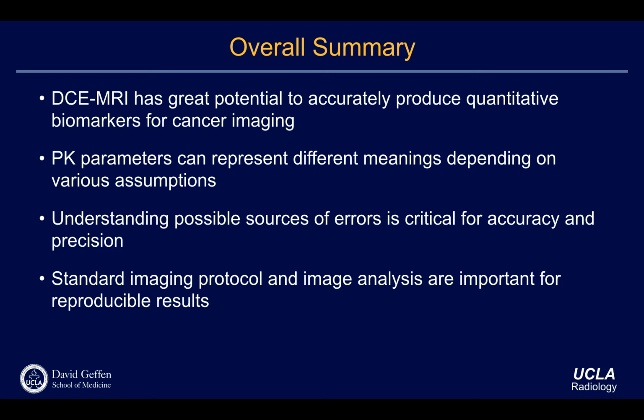But then you also have to think about it, right? If you're going to develop a quantitative imaging biomarker, it has to be reproducible and repeatable. If you're measuring your weight, depending on what scale you're using, if the number is different, how do you trust that? It's exactly the same way. If you're going to measure perfusion or diffusion or some other functional information, and you go to scanner A versus scanner B, and the numbers are not the same, or day 1 versus day 3, if the numbers are not consistent, then it's going to be a huge problem.